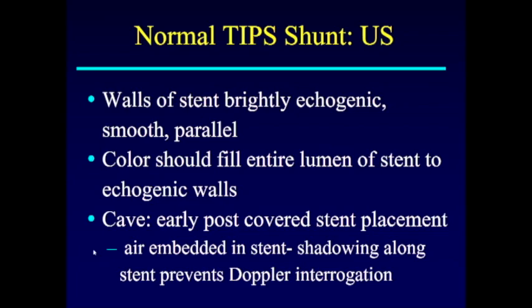On ultrasound, the walls of the stent are brightly echogenic. They should be smooth and parallel. When you turn on your color, it should fill the entire lumen of the shunt.